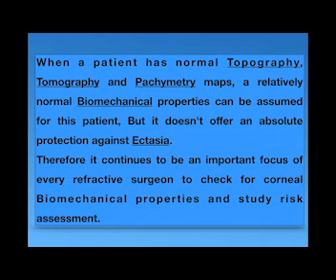So again, after 10 years of fading out of the corneal biomechanics, we are coming back now to put it in focus again. Last week, I met Professor Ambrosio 3 times, and every time he repeated that the corneal biomechanical properties are included in the new modules for studying the risk assessment and the patient's susceptibility to ectasia.